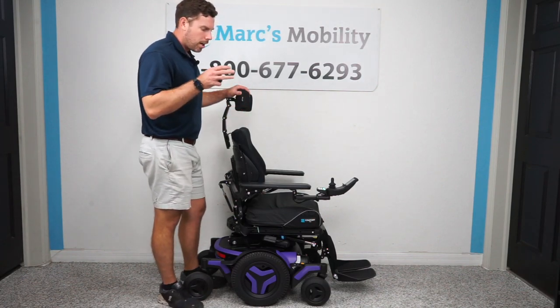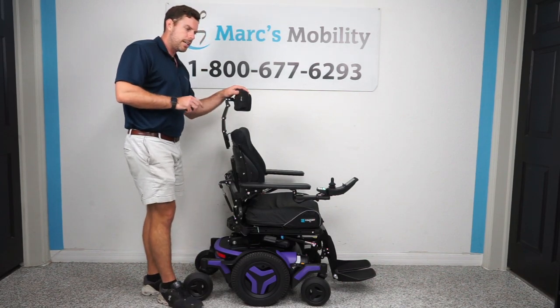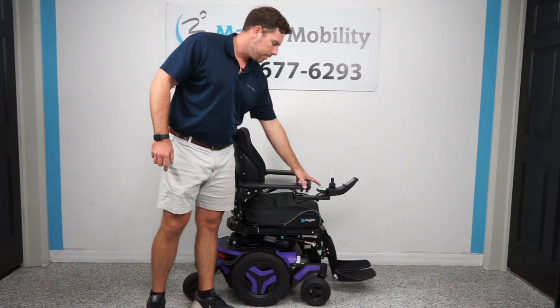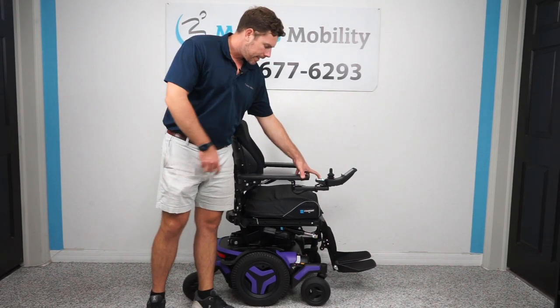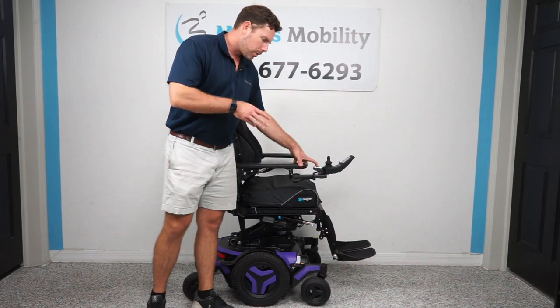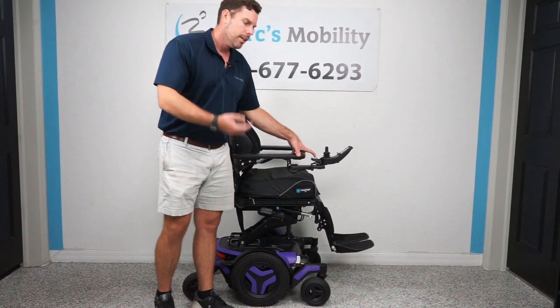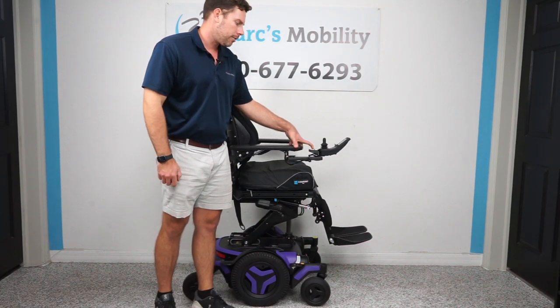This unit comes with all four functions: a 12-inch seat lift, electric tilt, electric recline, and electric legs. I'll show you what those functions are and what they do. The first function is your 12-inch vertical seat lift. Depending on what size cushion you put on, you're going to be 21 to 22 inches top of the seat to the ground. When you raise it 12 inches, you're going to be roughly about 34 inches top of the seat to the ground.